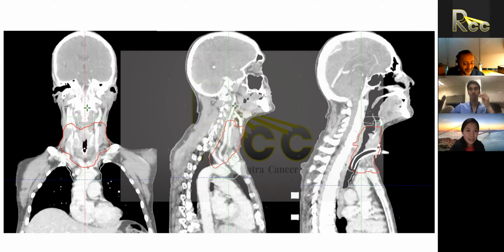You got it. I was just going to say that, Rochelle. If you remember the early days of IMRT, we used to actually split the fields. You would put the match line at the larynx and treat the volumes above the larynx with a VMAT plan, and then match the volume at the larynx with a single anterior photon field, very similar to the days of 2D and 3D head and neck radiotherapy.